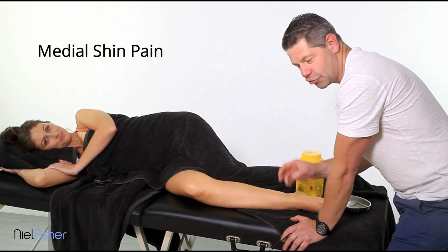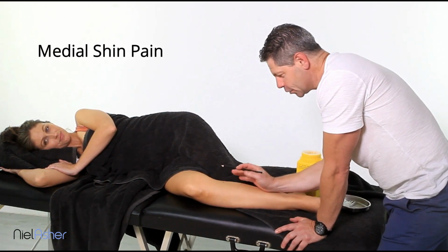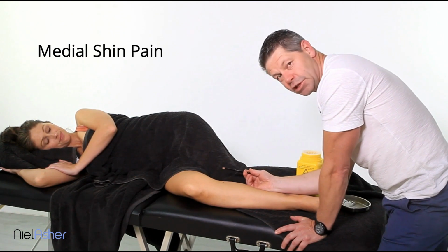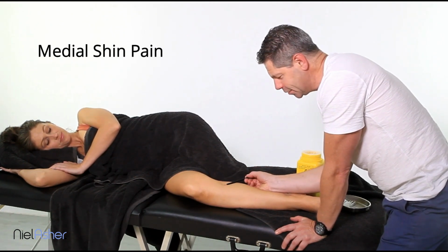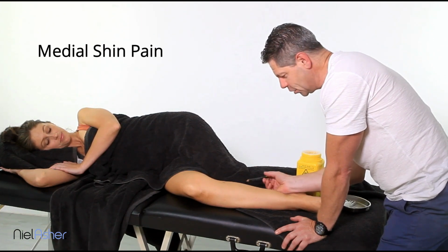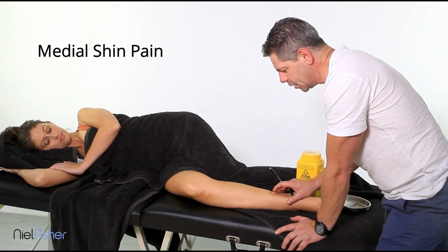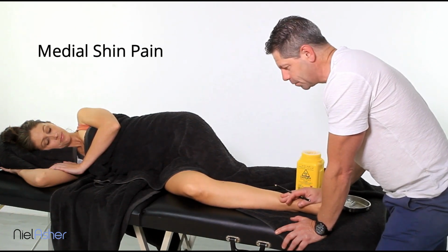So, trigger point dry needling for medial shin pain. I mentioned before, there are 4 muscles, the deep toe flexors, that we're looking at first. First one will be the Popliteus, then we come down and we've got tib post, flexor dig, and then obviously we can come down here and hit the medial soleus as well.